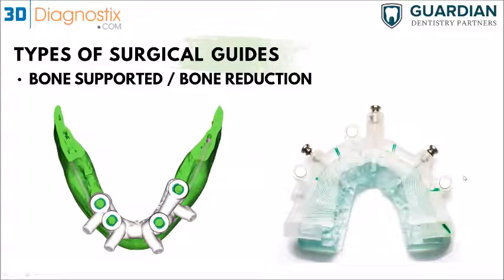And another type of bone supported guide would be the bone reduction. So this is actually a picture of our new guide design. Right now we're using the magnets, of course, to stabilize the guides on top of each other. So this is going to be the foundation. You're going to place it in and drill the osteotomies of the pin, stabilize the guide with the pins, of course.